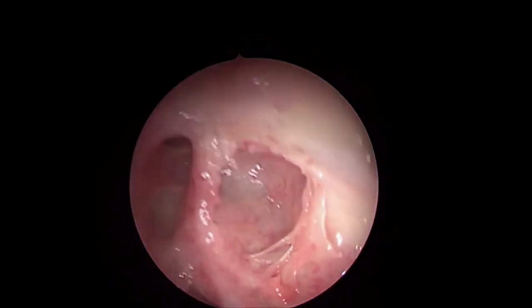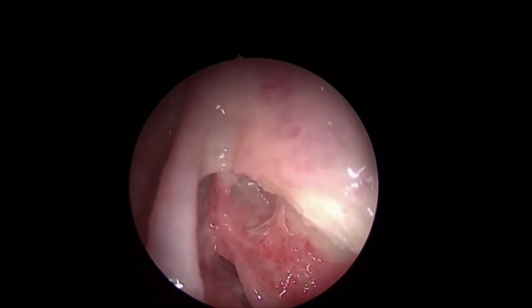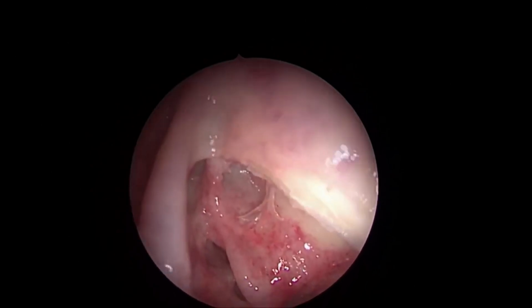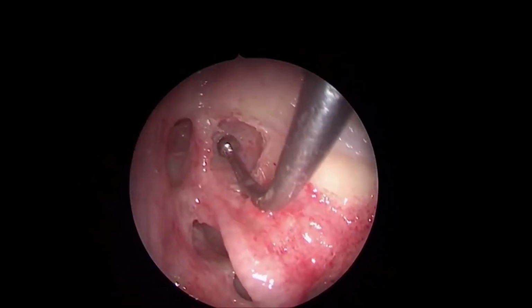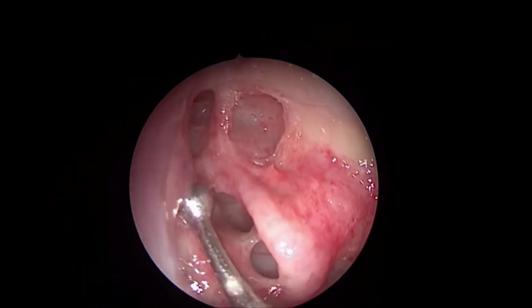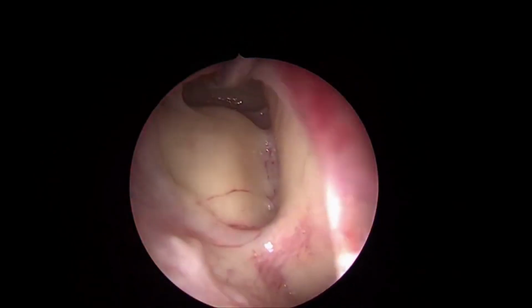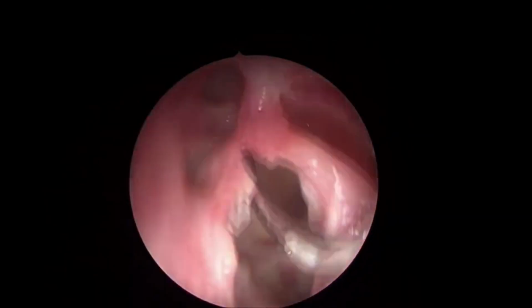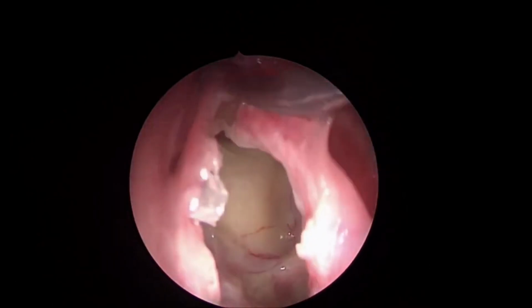So this beak now, if you follow, this frontal sinus drains from behind. Anteriorly it is flanked by the beak. So as long as you follow the beak behind, and where the beak ends is your frontal sinus. So now, see, this is your medial limit, this is your lateral limit, and this recess with a 70 degree, if I go inside, can you see the frontal? Yeah, very clear. See, so simple this is, such a favorable situation. Most favorable, like child's play now, if you have a 70 degree in hand.